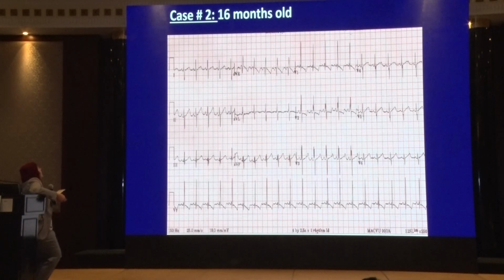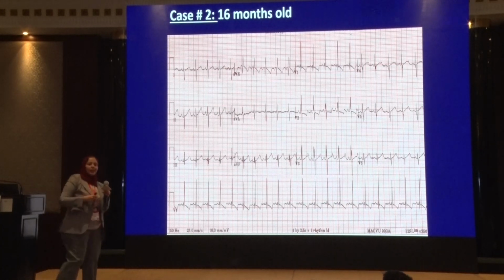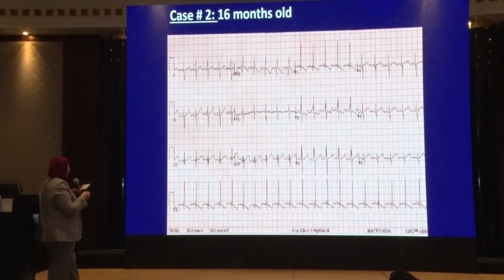Now we have this second case. Who will start? Who will start? Dr. Priyanka, you will start.